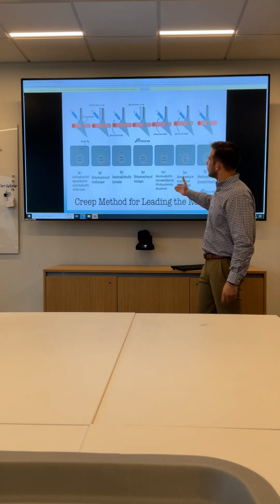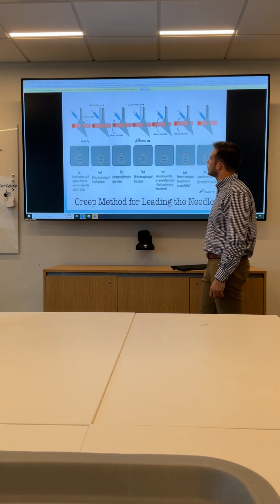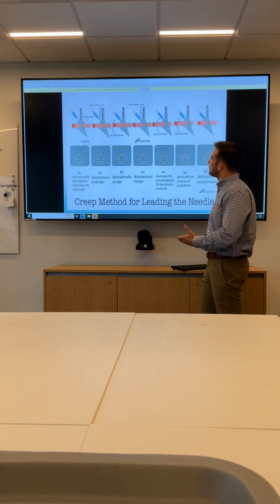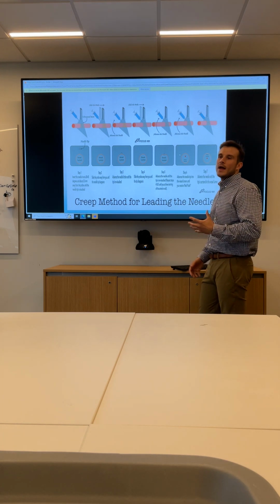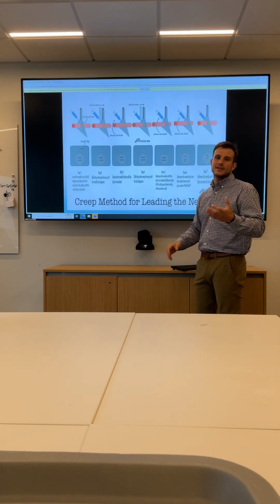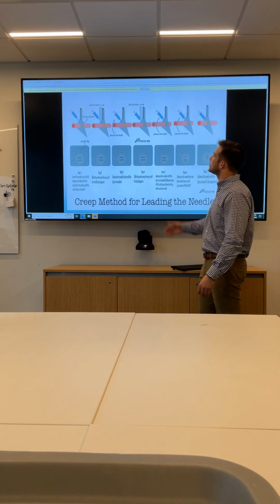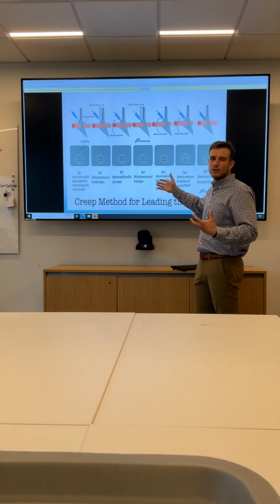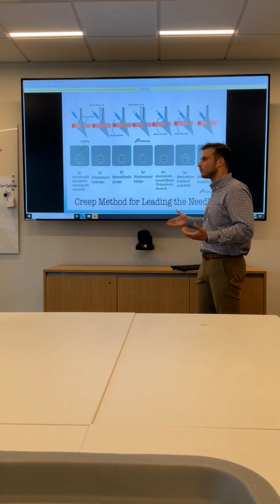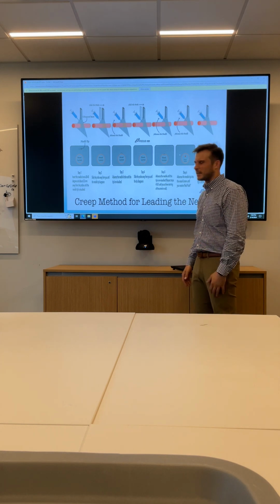So these are some steps here. You can take a look at this slide, and actually, I recommend printing this out. This one's multi-step purposes of how to actually go through it. For those that are visual learners, this is great. They call this the creep method, and that's essentially what we were just talking about, those subtle movements. You creep it up, poke it through, creep it up, poke it through, creep it up, poke it through. So this is something to help, review before you go in and stick the patient if you're really nervous or having trouble with it. But really, practice makes perfect.